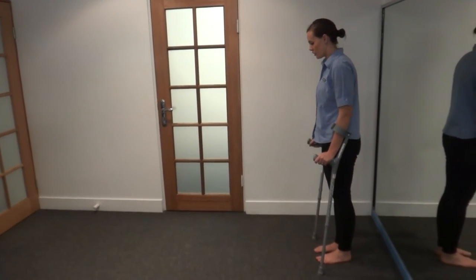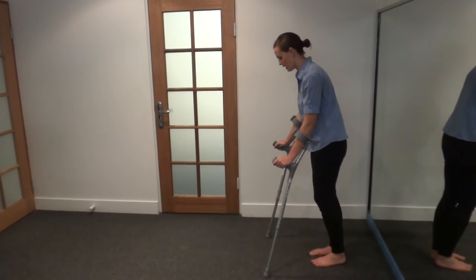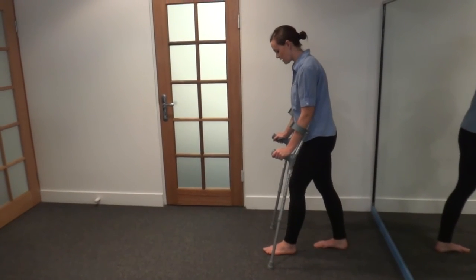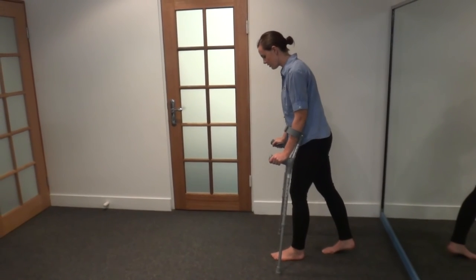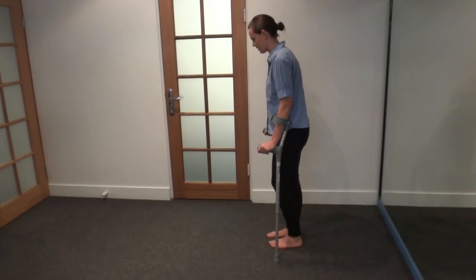Popping your crutches forward just a nice short distance, making sure that they're wider than the body. Placing your touch weight bearing foot forward in line with the crutch, only putting about 5% of your body weight down. The remainder of the weight is going to go down through your hands, and you step to the line of the crutch.